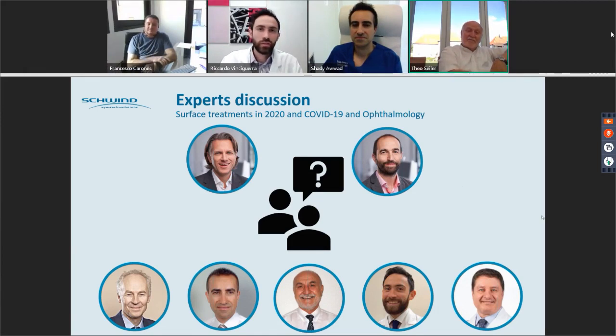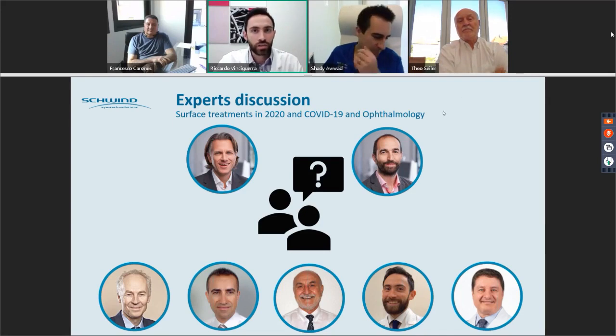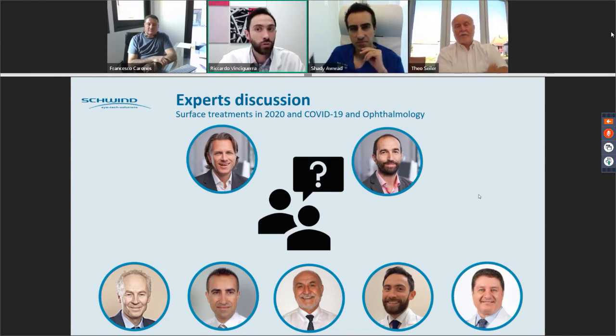I think that we had a long discussion actually with another group, because this was done by the UK Optometrist Society, in which they suggested not to use any non-contact tonometer because it could potentially create aerosol. So what I think is critical to say is that the evidence in literature about how much is positive in PCR conjunctival swab is between 0% and about 8 to 10%. It depends which one you see. And these are hospitalized patients with pneumonia. So even if it creates aerosol, are we really sure that this would make a difference? We don't know. That's the real answer.